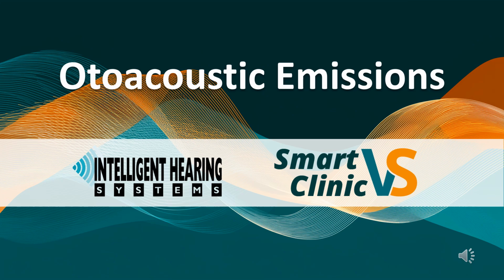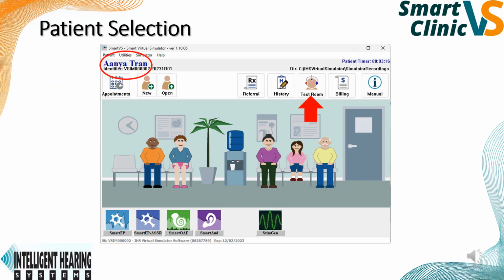In this video, you will learn how to conduct a transient evoked otoacoustic emission and a distortion product otoacoustic emission. The first step is to select your patient. This can be done by going to the Appointments button and choosing your patient. In this case, we will be using Anya Tran. After we've selected our patient, click on the test room.